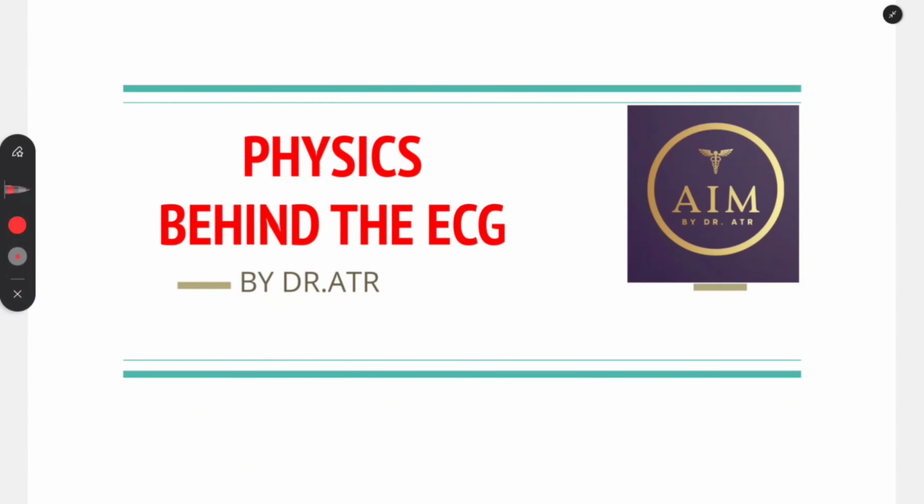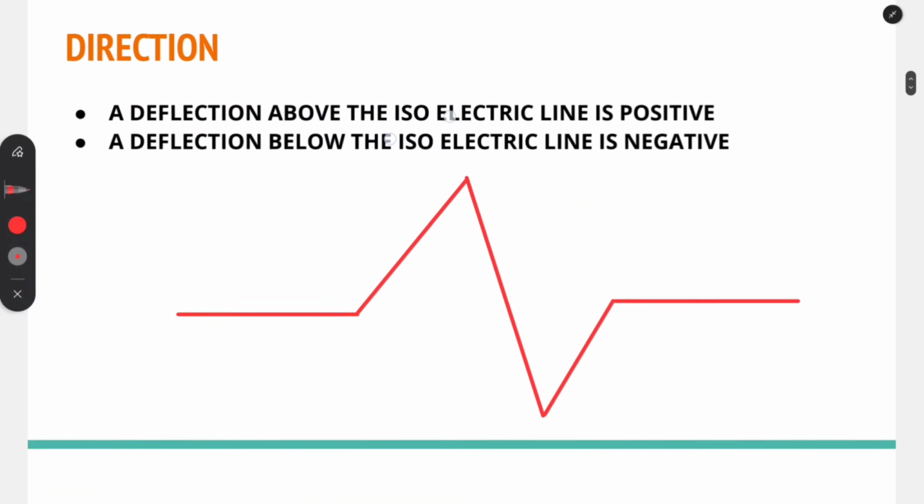Before learning the genesis of each wave on an ECG, one should know the basic physics behind the ECG. In this video, let's learn some basic physics behind the ECG. Let's start with the direction.